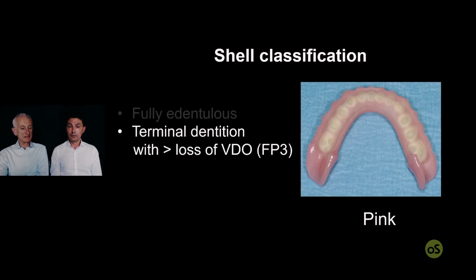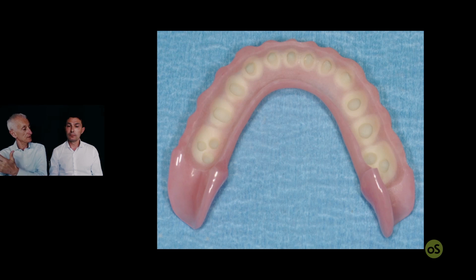No, this is another. That was a restoration made for a patient that was already fully edentulous. Yes. Okay, so basically, you copy some information from the existing denture. Yes. Okay, given that this denture was more or less okay. If it's not okay, we will probably make another denture.